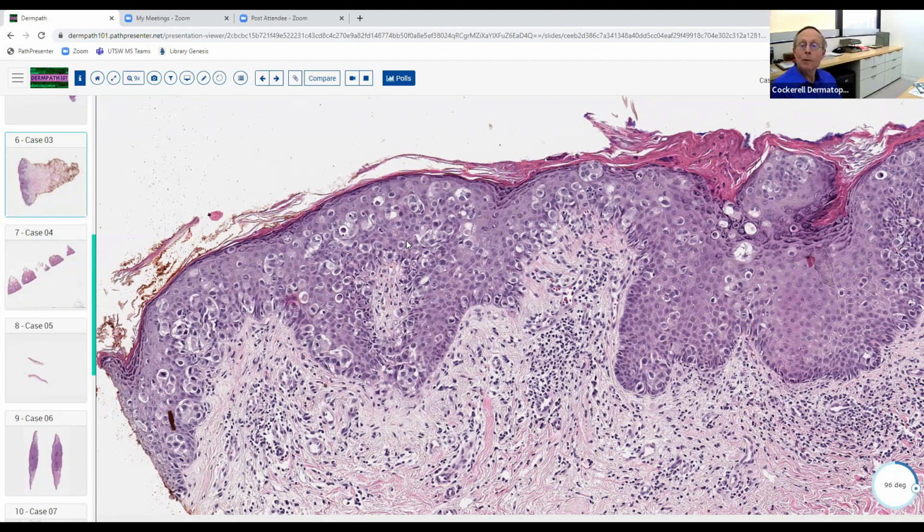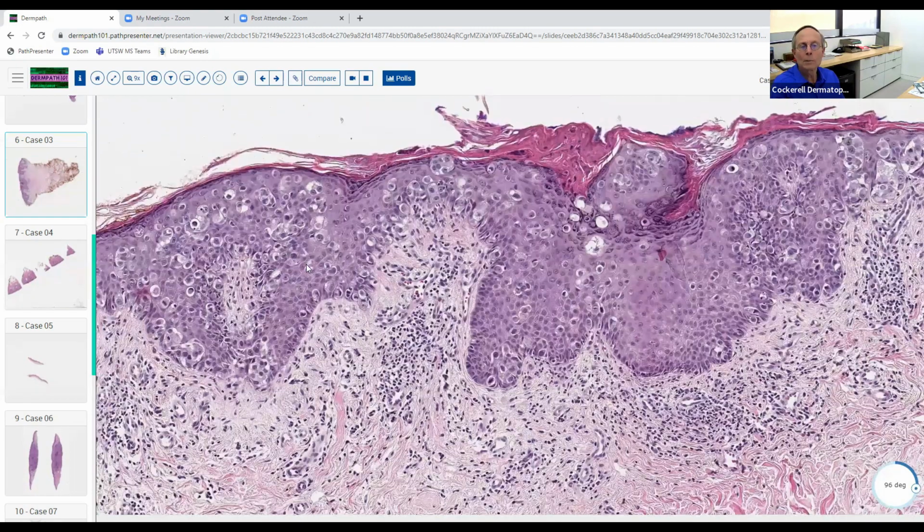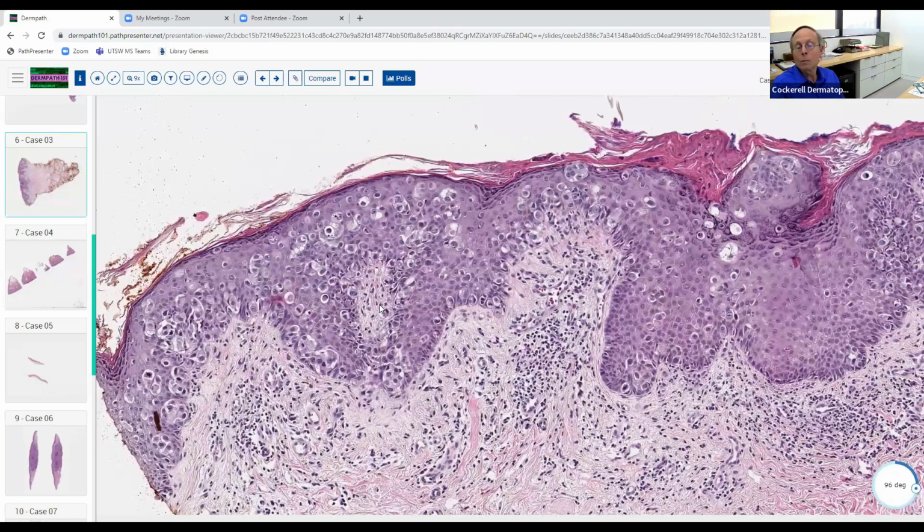That's good. You've got 90% of them or more. The other one that can do this on occasion is Merkel cell carcinoma. I believe you mentioned malignant melanoma. I think you said that. That's definitely one. And then there's one or two others. You said Langerhans cell histiocytosis. That's good. There's a condition called pagetoid reticulosis, which is mycosis fungoides, the so-called Woringer-Kolopp or the Ketron-Goodman form of those diseases, where they can get lymphoid cells in there. Lymphomatoid papulosis can do it on occasion. It's less common than mycosis fungoides, but it is possible. So that's pretty much it right there. If you can get those, you're in good shape.